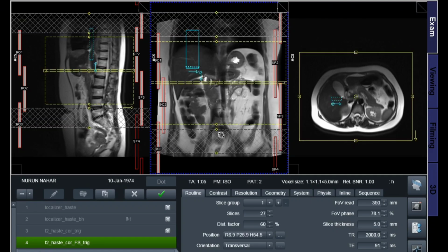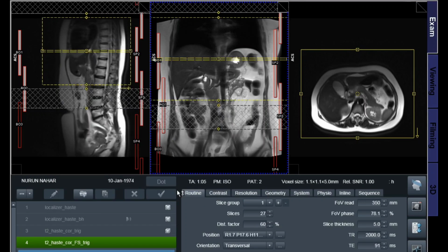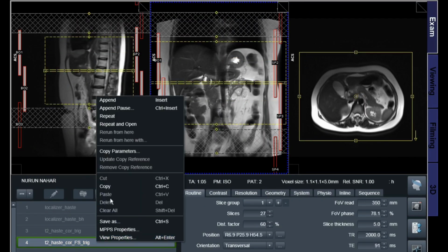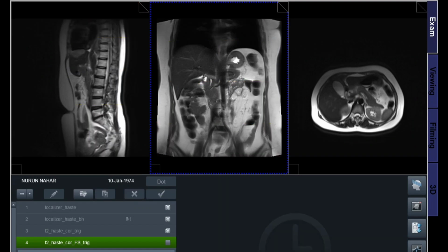MRI technique. The patient is placed in a supine position. MRI HBS is performed using a phased array body coil. The patient is instructed to hold breath during image acquisition to reduce motion artifacts. Scanning time usually ranges from 20 to 40 minutes.